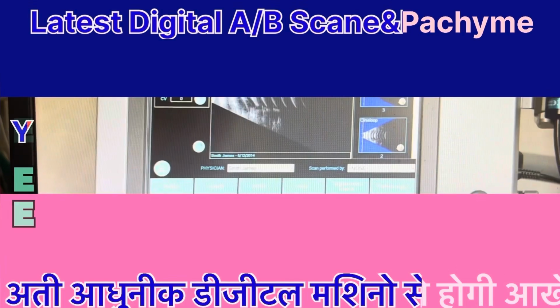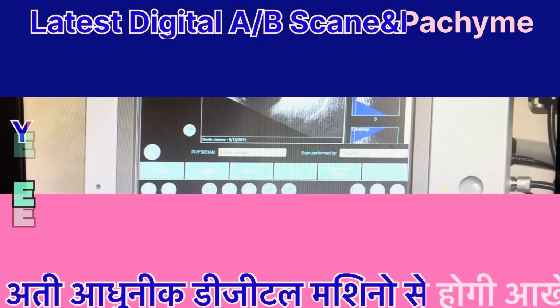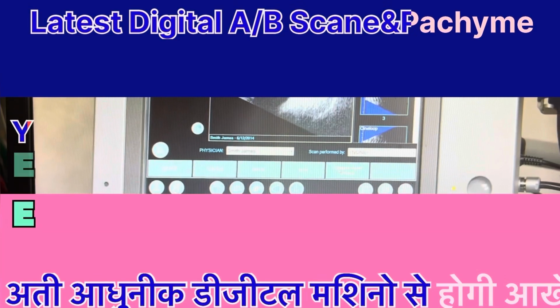To save a frozen image on the screen, select the Save icon and press the foot pedal for more than 1 second. Or, if using a mouse, right-click and select Export to JPEG. Multiple images can be added to a B-scan report.